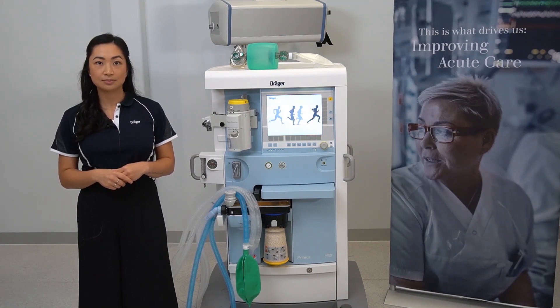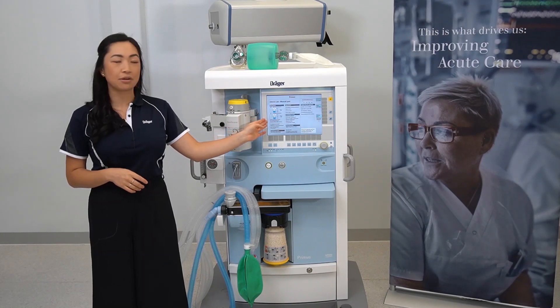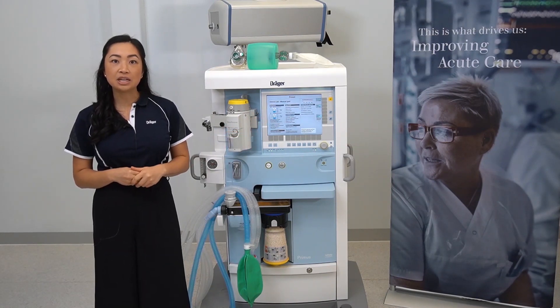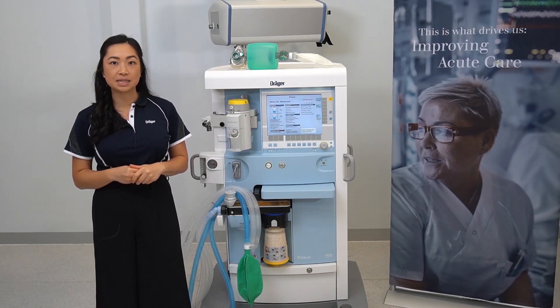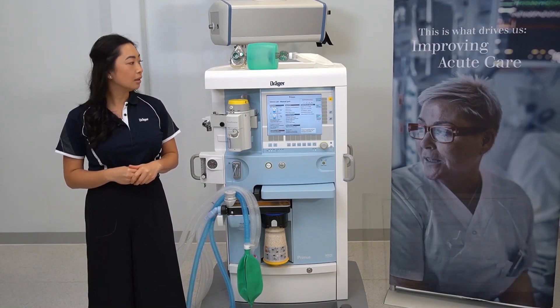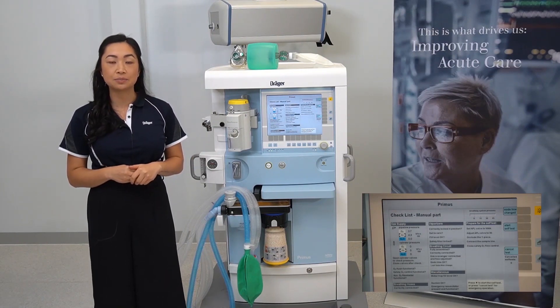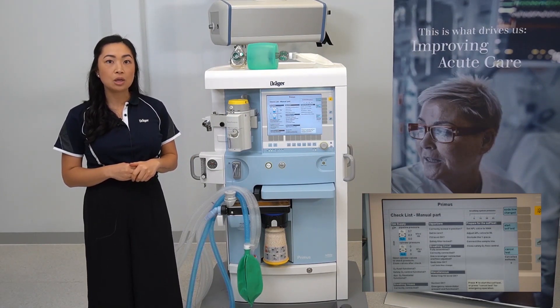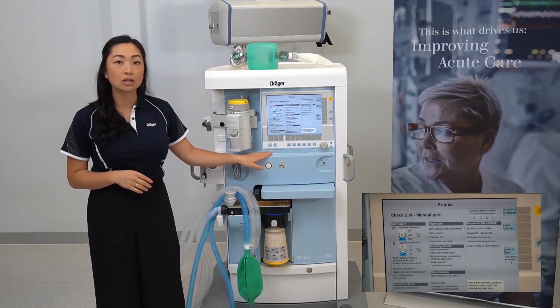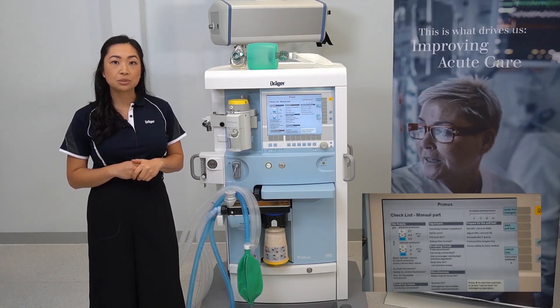Your device will power up to this screen. To manually prepare the machine for the system test, follow the instructions listed on the screen. To check your pipeline pressures are adequate, connect your hoses up to the central gas supply. You will then see a corresponding solid LED light under each gas.